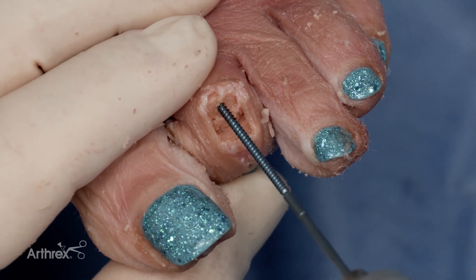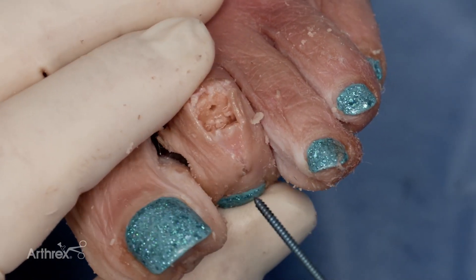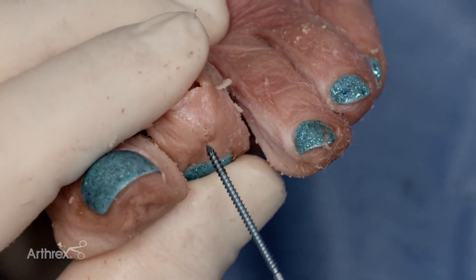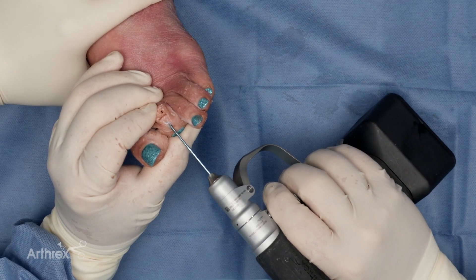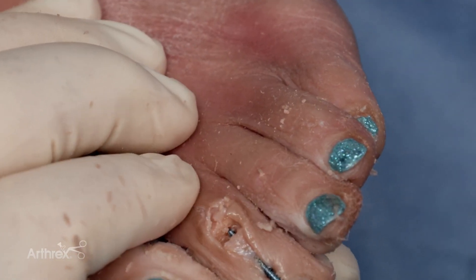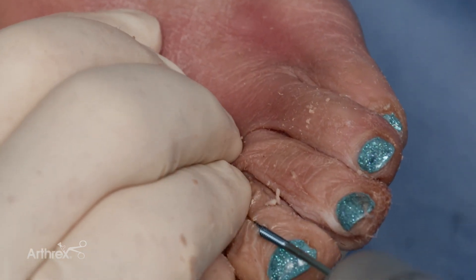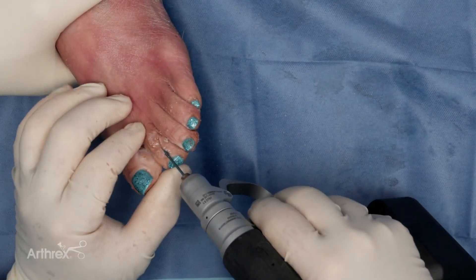It's helpful to make a small track in the proximal phalanx. This aids in insertion of the implant. The 1.9 implant is then passed from the distal aspect of the middle phalanx proximally, crossing the proposed arthrodesis site, and then driven into the proximal phalanx.